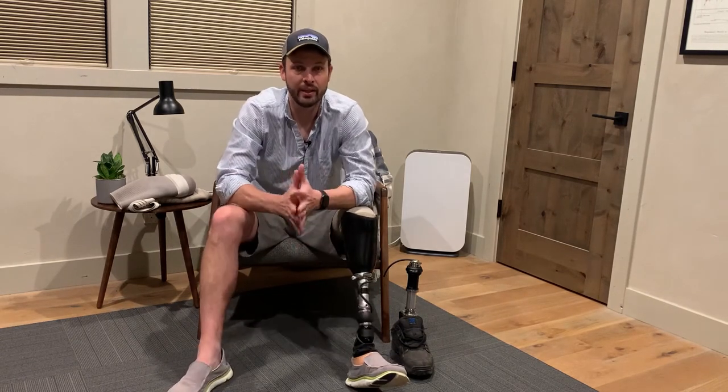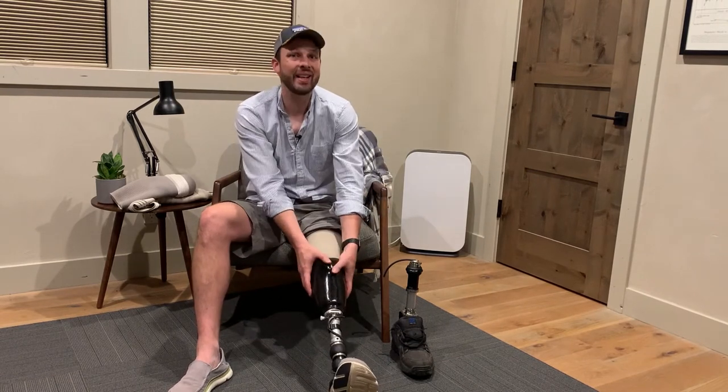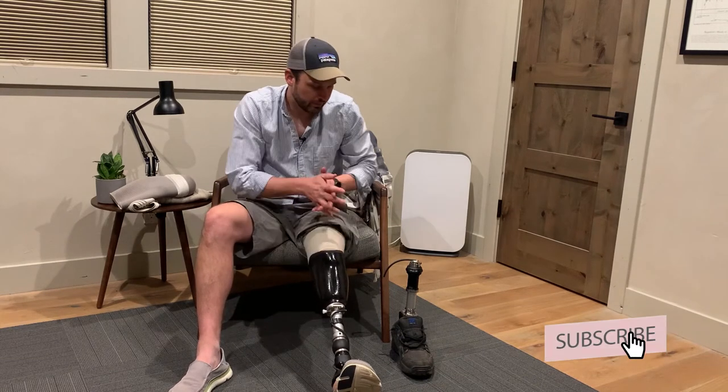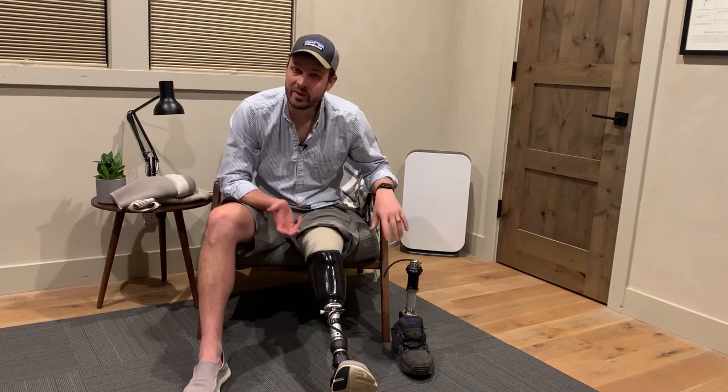That said, the security is awesome. This is the most secure I've ever felt in a socket, and it really makes a big difference. And if I want to, I can always add an old sleeve over the top and get an even better seal for activities, which is nice.